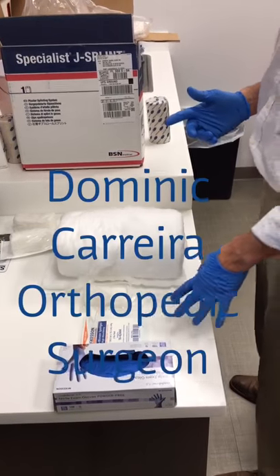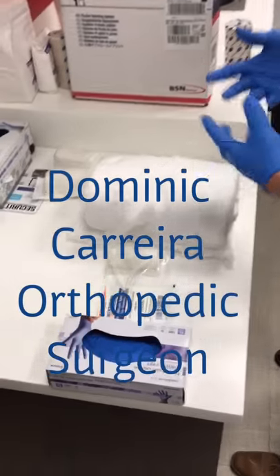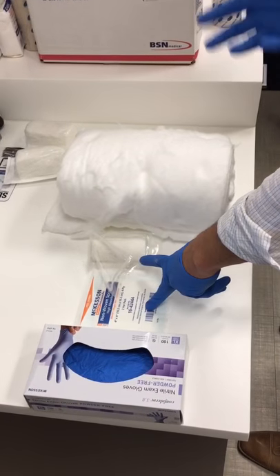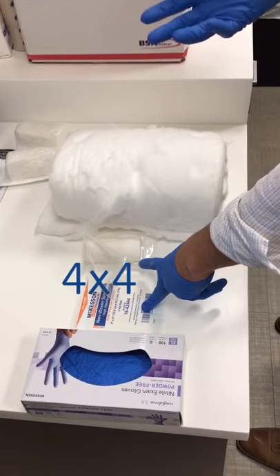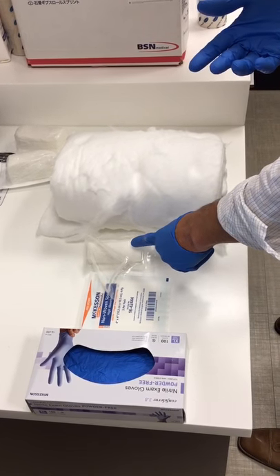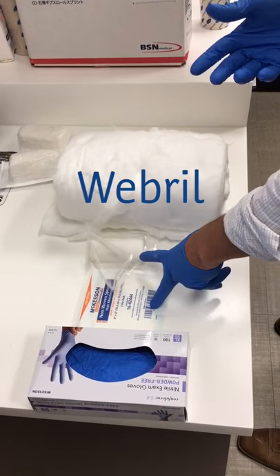The equipment for a bulky Jones dressing — in this case I'm going to assume that there's a surgical incision or maybe even blistering — so we're going to do 4x4s. Under the 4x4 you can put whatever dressing you would want, like a Xeroform, and then a Webril to hold that dressing in place.